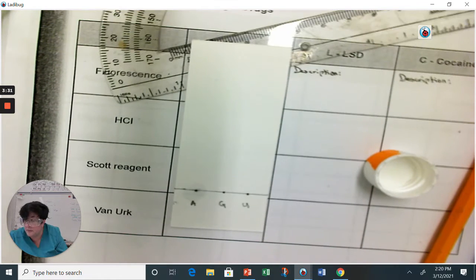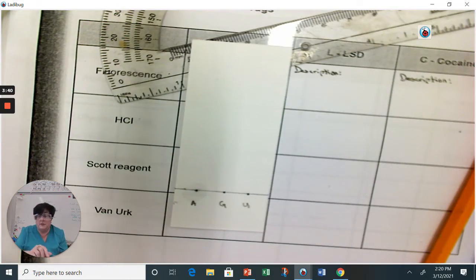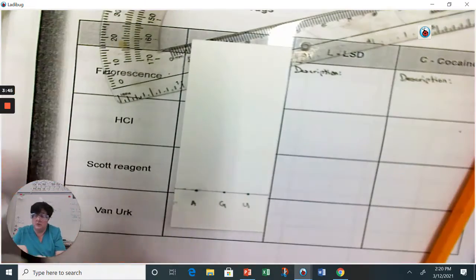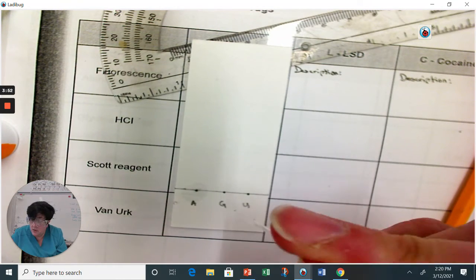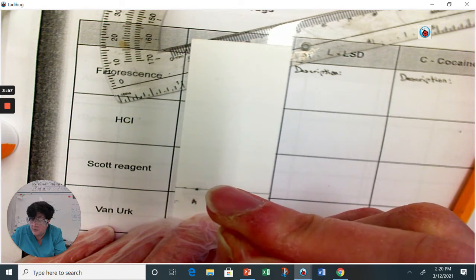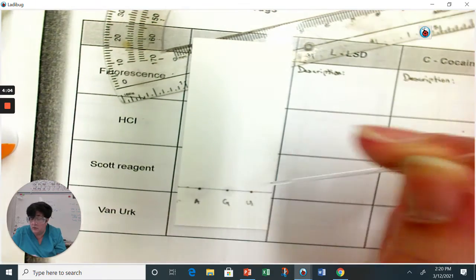That's the glycine. I'm sorry, that was the alanine. It was not the glycine. See, I took the alanine control so that you know I didn't make a big boo-boo there. I said it was glycine, but it was alanine. So here's my glycine control. Control meaning it will behave a certain way, it'll run a certain way, and then we compare it to the urine. And see if I can make smaller little dabs here. I don't know if that alanine is going to mess it up because the dabs are awfully big, and that's an awfully big circle there.